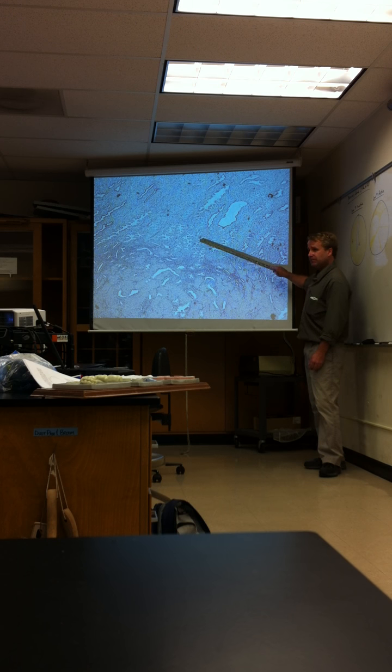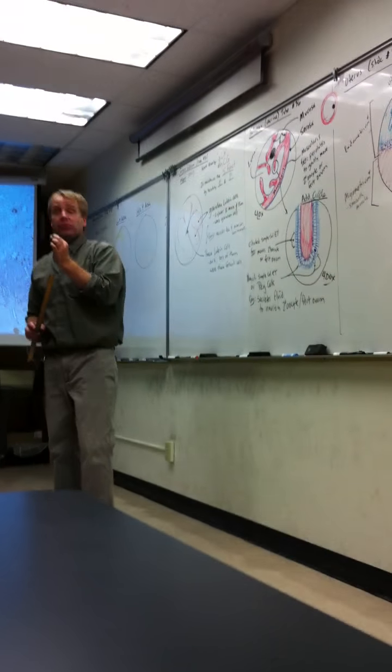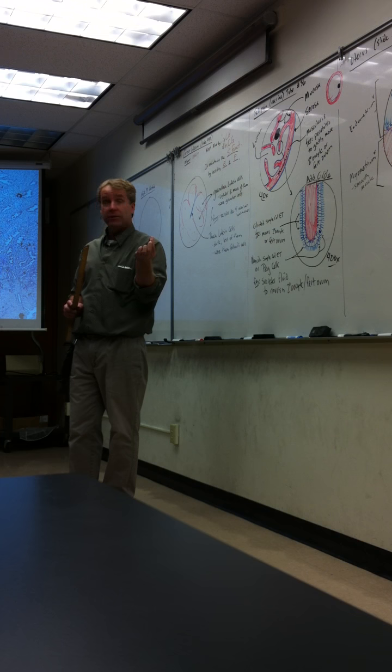Any questions of this? One other point here, in your lab manual, it says uterus secretory phase. And so I won't require that you say secretory phase for the specimen. Secretory phase is one of the phases of the uterine cycle, and we'll go over that on Thursday.